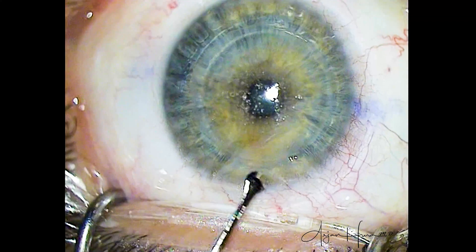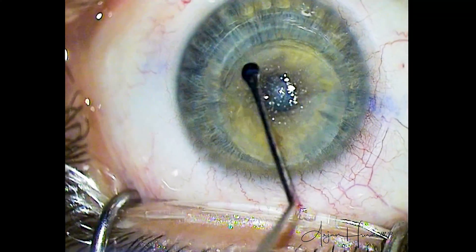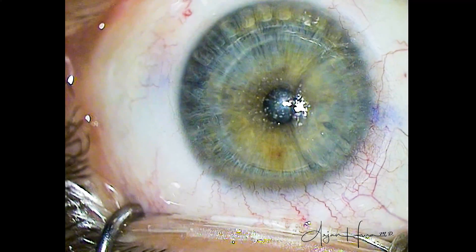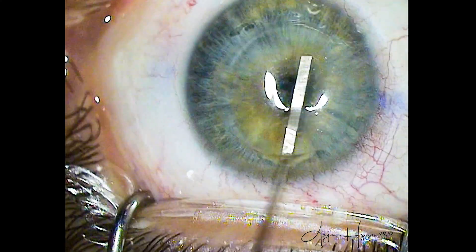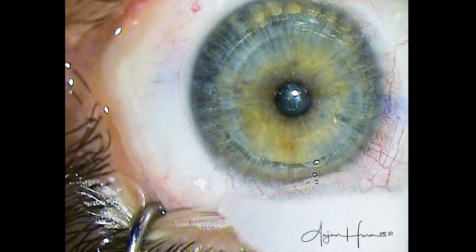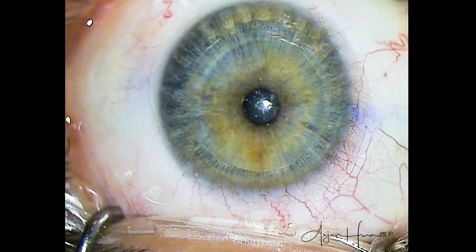So now just gently going in posteriorly, I'm breaking the lenticular adhesions, breaking my anchor points, and you can see that the lenticule just gently comes out nicely here, and I'm just smoothing it out. Even though I know it came out in one piece, I want to make sure there is no chance of having any tissue remnants or tags in the interface. Some surgeons will skip the next step, where I take the irrigation cannula, re-enter the SMILE pocket, and just gently flush out the interface.